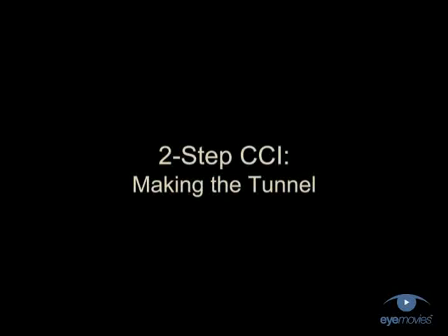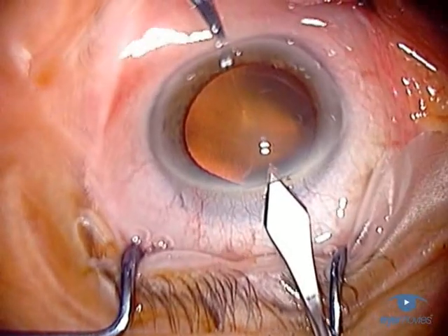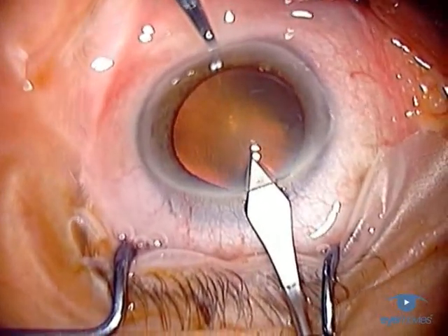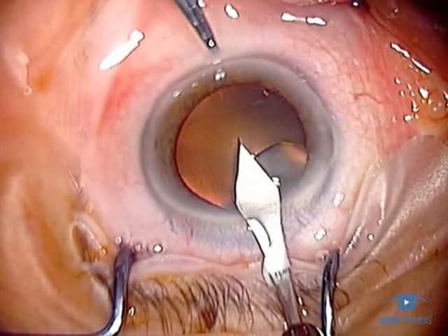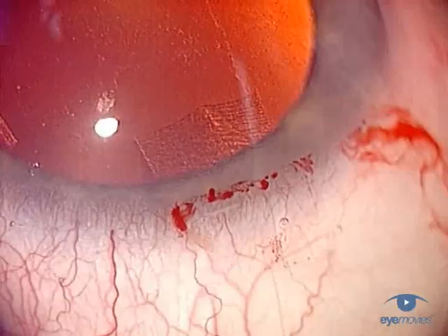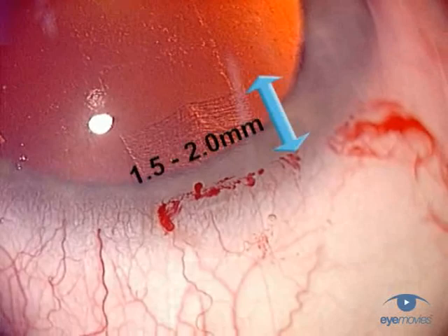To make the tunnel, firstly engage the tip of the keratome in the base of the groove. Then, with the blade pressed flat down and pointing slightly upwards, make a steady and controlled pass of the keratome through the corneal stroma and into the chamber up to the full width of the blade. You should be aiming for a tunnel length of about 2 mm to give a self-sealing and stable wound.